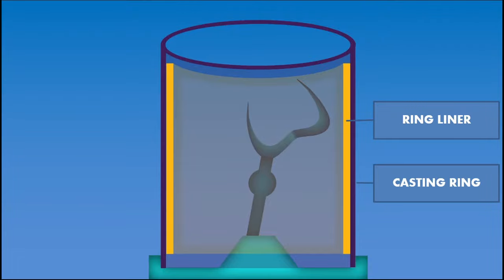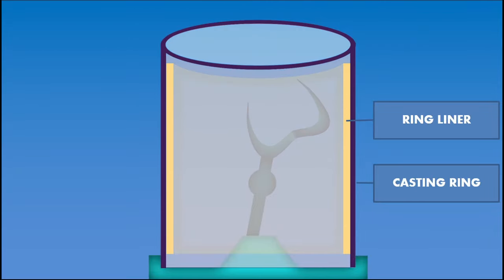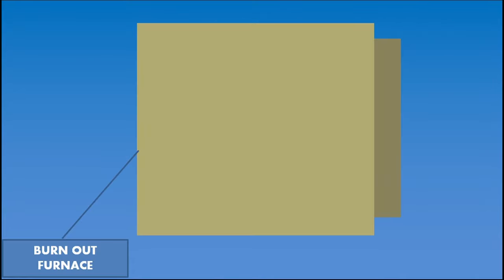Next step is to mix the investment material, which can be a gypsum bonded investment for gold alloys and phosphate bonded investment for base metal alloys. The casting ring is filled. Care should be taken to avoid air entrapment. The wax pattern gets entrapped inside the investment material. The investment is allowed to set completely before the next step.